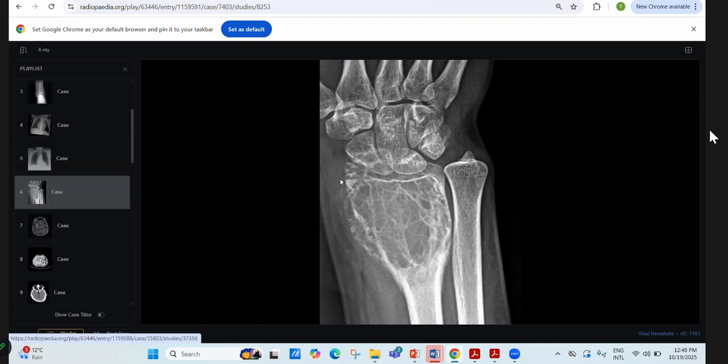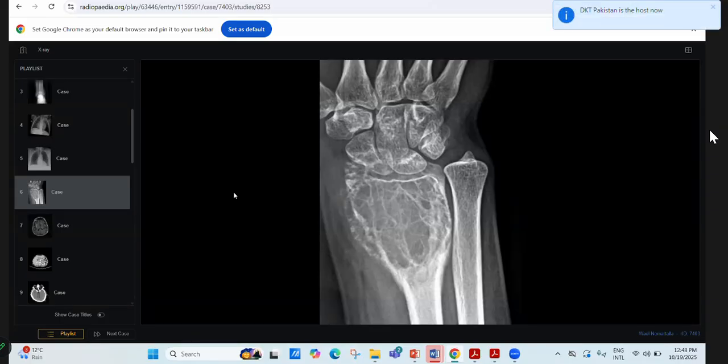You did really well in this, but I don't think so. You mentioned many differentials for this? No, one differential only. Yeah, but again, you are right that if it is so typical you could say, okay, it is that, but for the sake of the exam, give 2 to 3 differentials in MSK films, because there is GCT transformation of ABC as well, and different others. Chondroma and everything can also change into GCT and ABCs. So you should mention them.